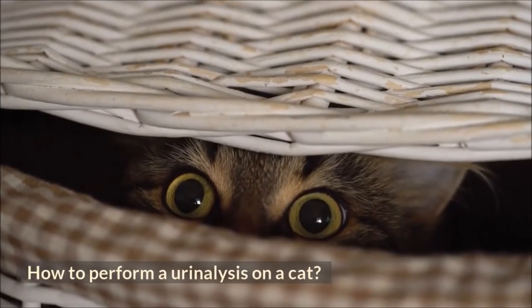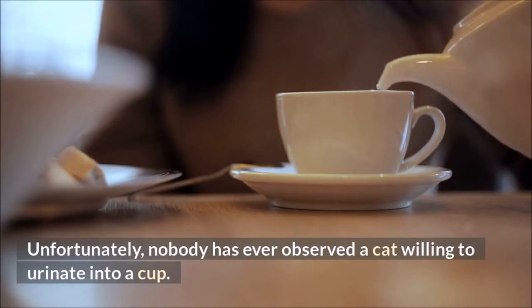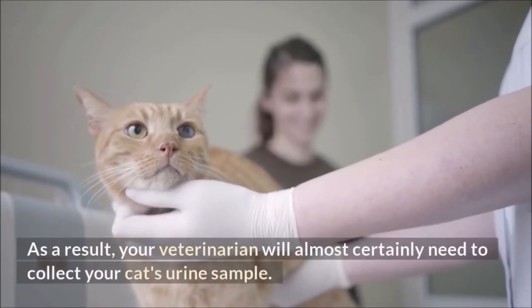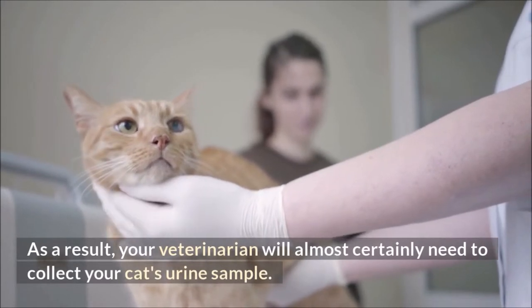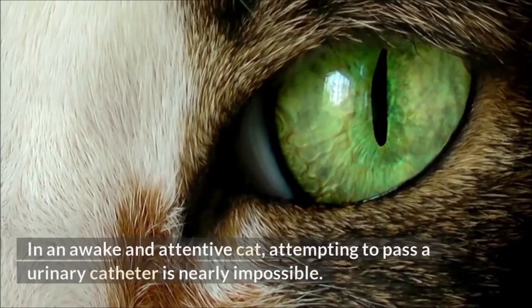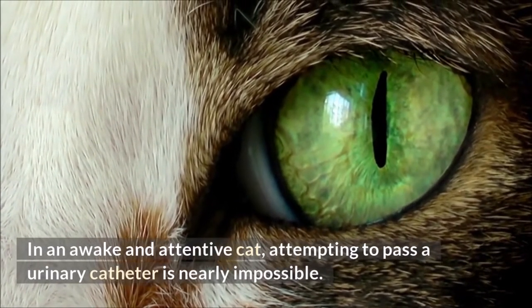How to perform a urinalysis on a cat. Unfortunately, nobody has ever observed a cat willing to urinate into a cup. As a result, your veterinarian will almost certainly need to collect your cat's urine sample. In an awake and attentive cat, attempting to pass a urinary catheter is nearly impossible.